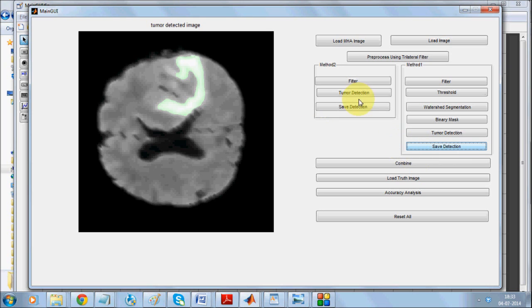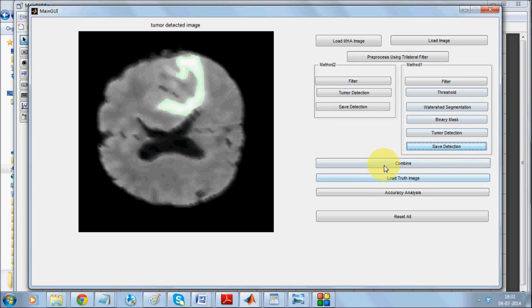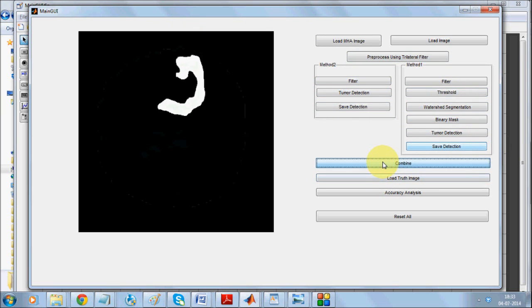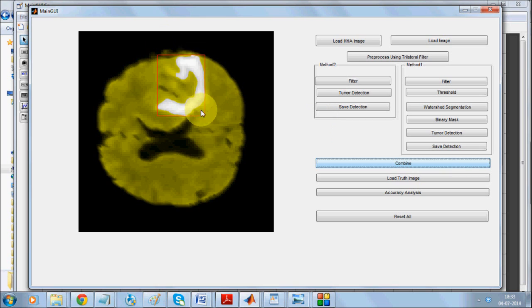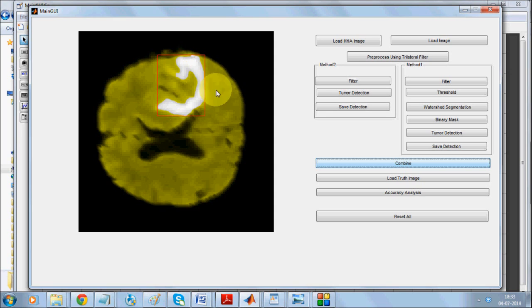As you can see it marks the whole tumor area. We'll save this detection. Now we can actually combine the result of EM segmentation-based technique and median-based technique. These techniques are going to be combined to give us the exact area where the segmentation has occurred. Both methods will be plotted together, so the system is detecting the area where the brain tumor appears.